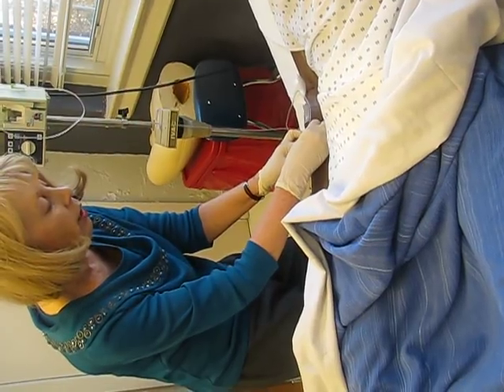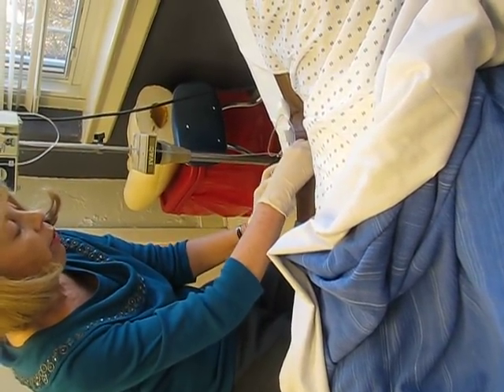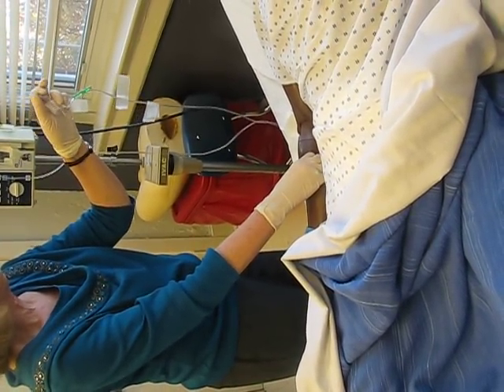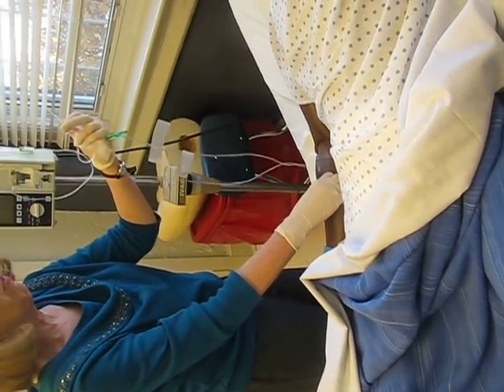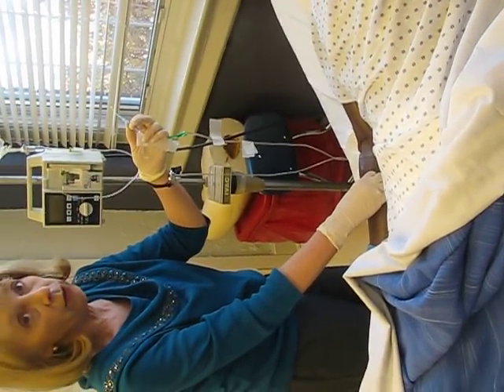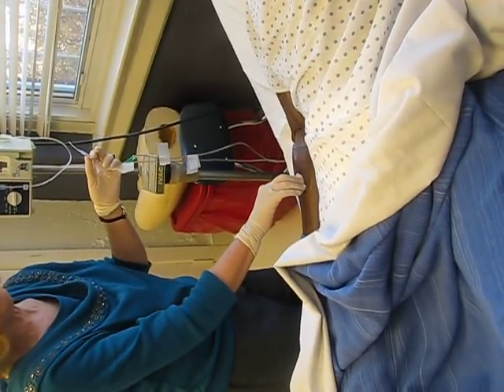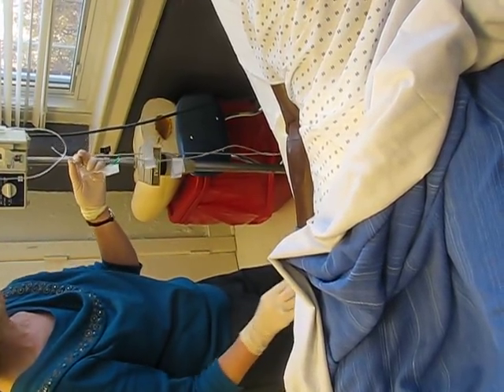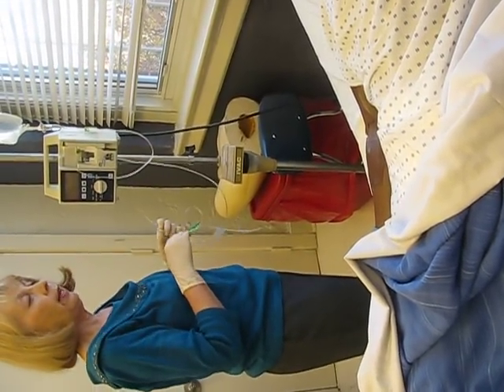Pull it horizontally and then put pressure. You want to examine your catheter to see that you have the whole catheter and that part of it is not broken off and floating in the bloodstream. You want to make sure there's no pus, because infection control will have to be notified if there is. About one to three minutes of pressure, then put a band-aid on it. If somebody's on Warfarin, it may take a little bit longer for them to clot. And that's it.